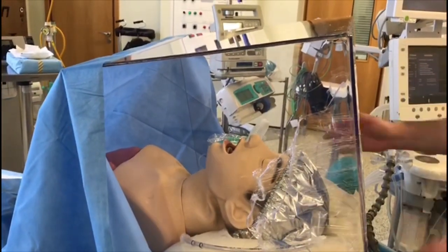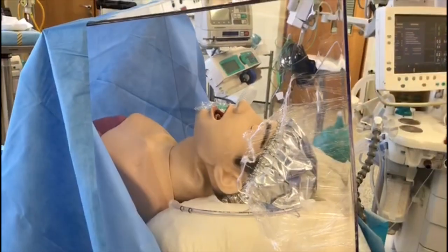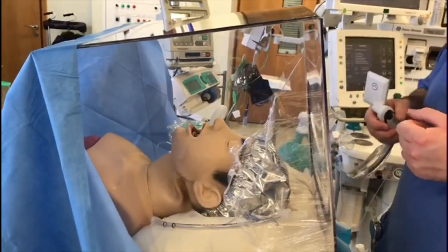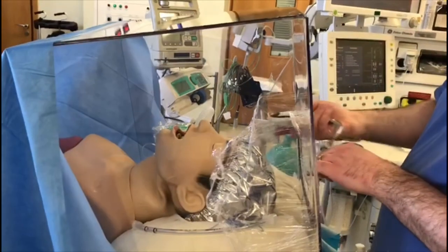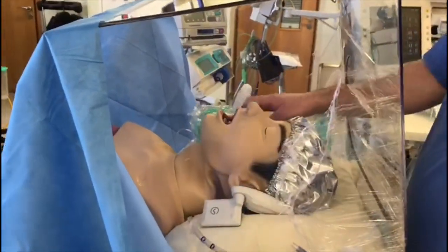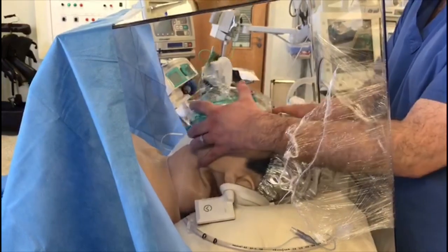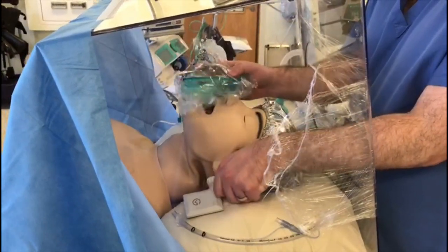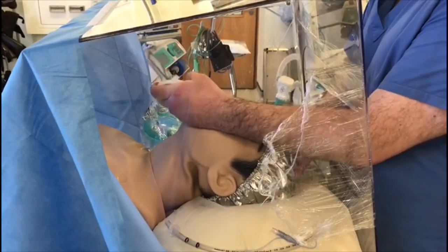So we have our anaesthetic set up, we have our circuit coming from below, we have the tube already in there loaded with a stylet. In the real situation I would be wearing gloves and a long-sleeve surgical gown to protect my arms. But for our purposes, we can see that it's quite easy through the slit and the clean film to move in and out. I can move the head, I can position for intubation, I can have the mask on, and I can pre-oxygenate the patient before intubation. Once I'm ready to intubate after giving my drugs, it's quite easy to get the laryngoscope in and get the optimal view.